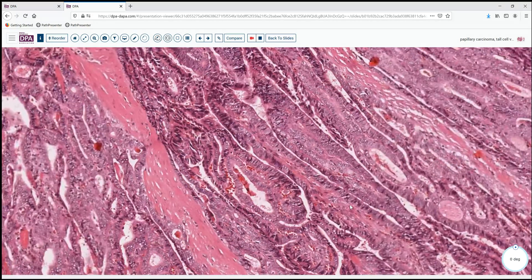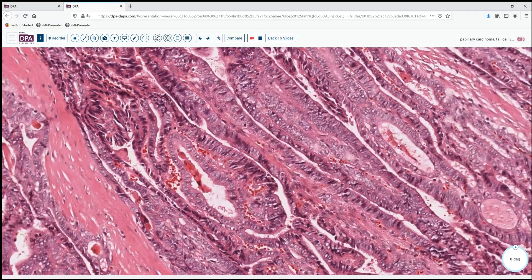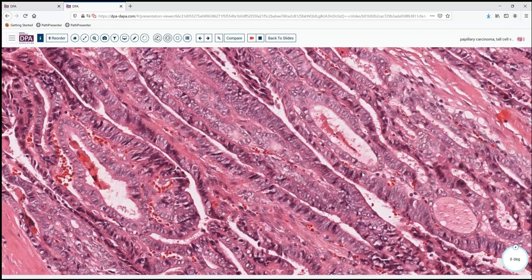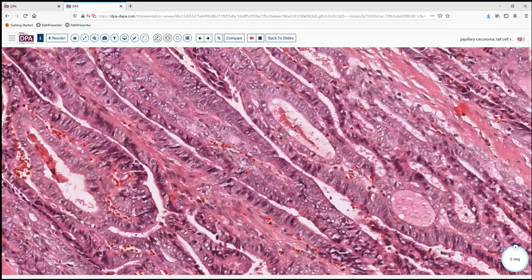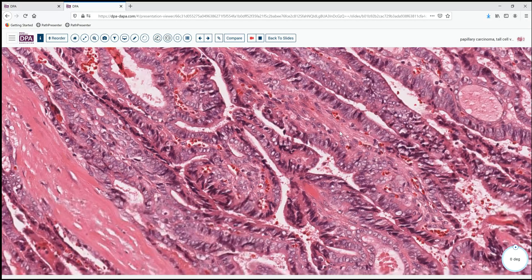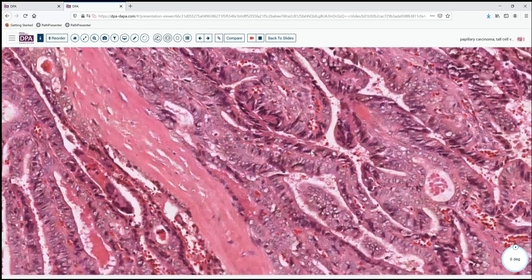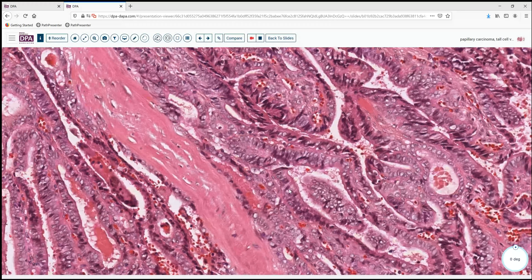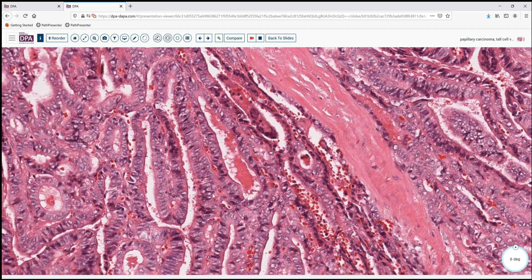Each of these papillae or elongated structures is lined by stratified or slightly stratified epithelia. Looking at this a little more closely, we can see that although the nuclei occupy a portion of it, in many cases, or at least in a fair percentage of the cases, the total cell size is two to two and a half times as large as the nuclei, not in all cells, but in a significant portion of them.